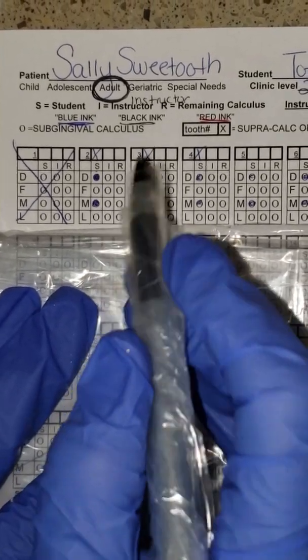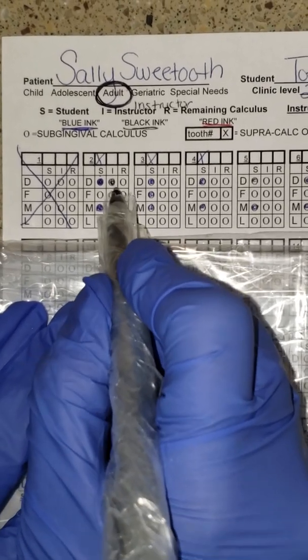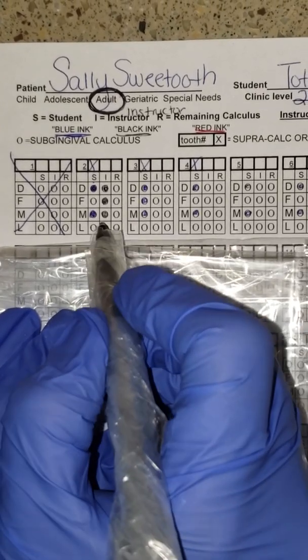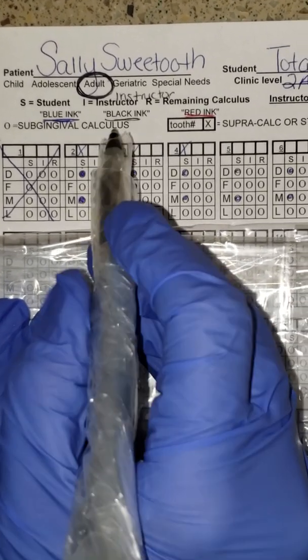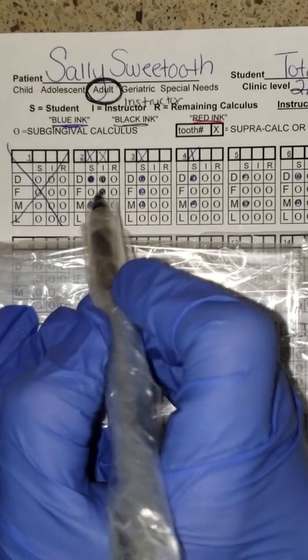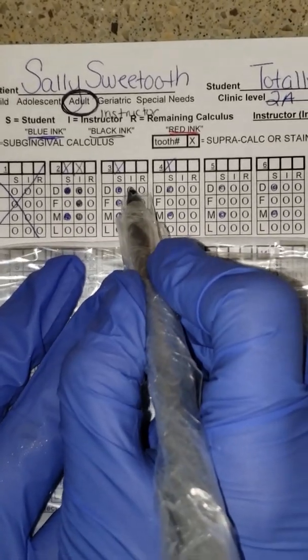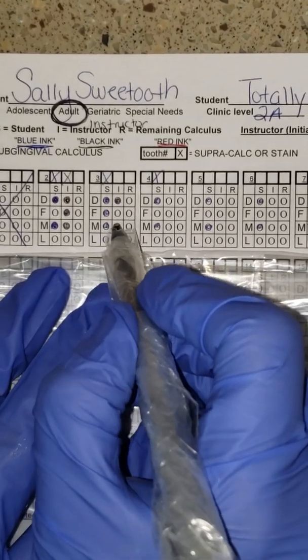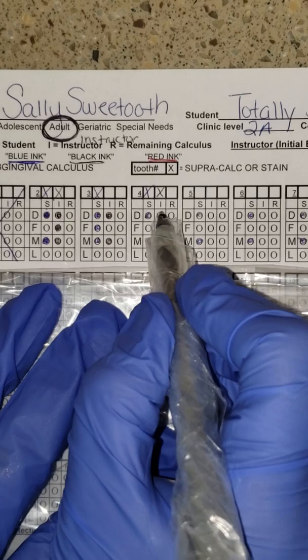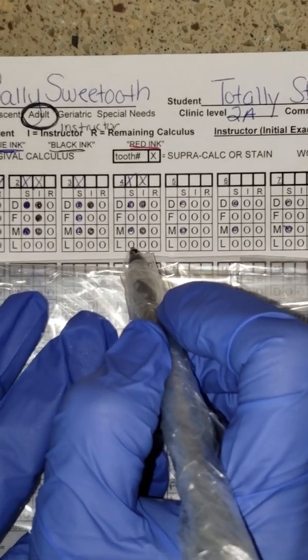So the instructor finds number 2 has distal, mesial, and facial deposit, definitive speed bump deposit, subgingivally. And they find that yes, there is supra. Then they're moving on. Let's say they have distal and mesial. So you're going to just write down the corresponding with what the instructor tells you and what they're verifying during your initial exam.